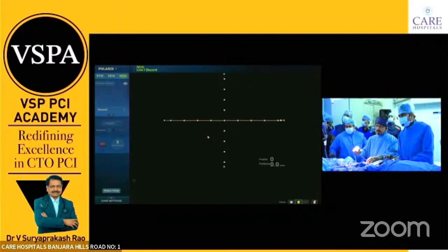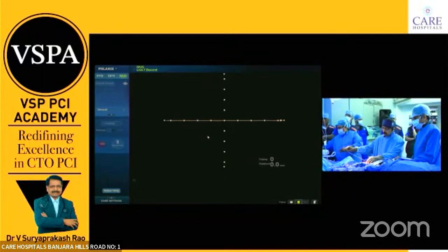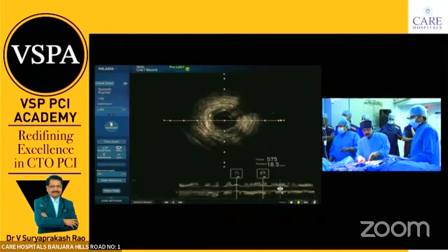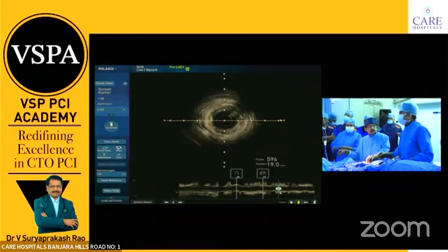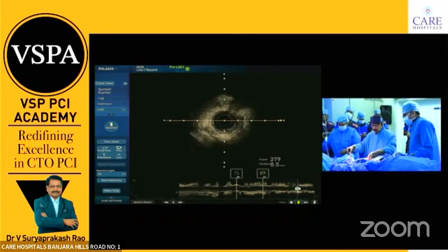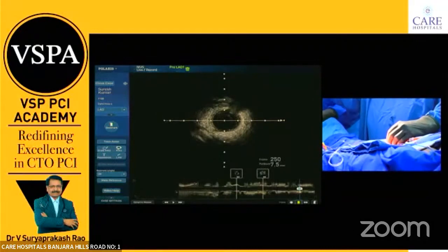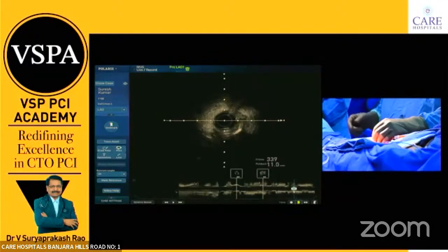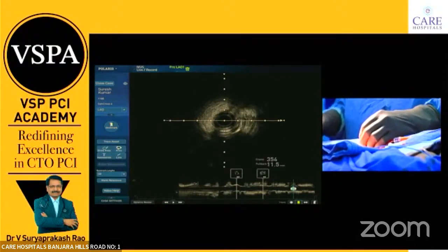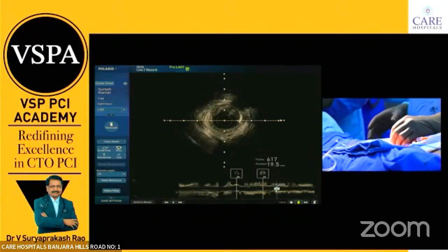Tell me the distal diameter at the mid portion of the CTO and proximal. There's calcium at the CTO segment there.